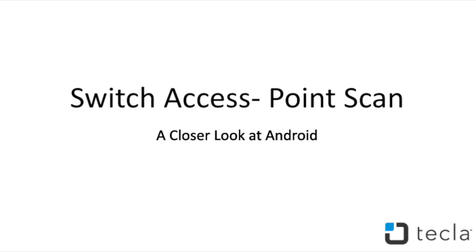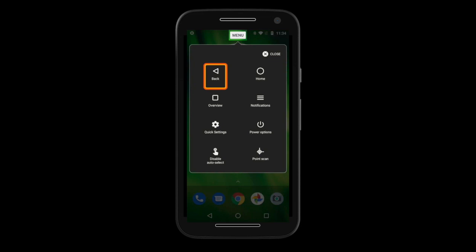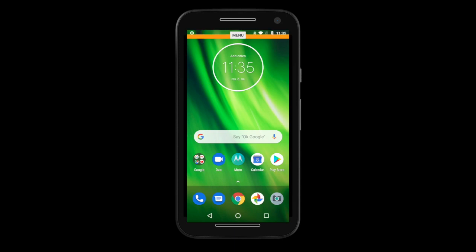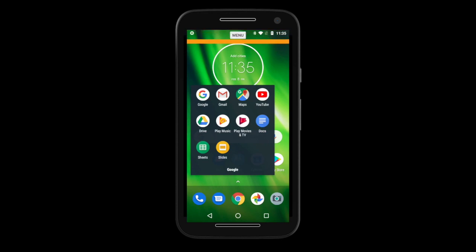Point Scan: in addition to Item Scan, Switch Access also has Point Scan. Here you can select any point of the screen and interact with it as if you were using a touch screen. To switch to Point Scan, select the menu button, navigate to Point Scan and select it. Now you will be able to select a point on the screen using crosshairs. A bar will first come from the top to the bottom — use your selector switch to activate it. Then a bar will move from left to right to select a point. Once you select a point, a tap will be performed.